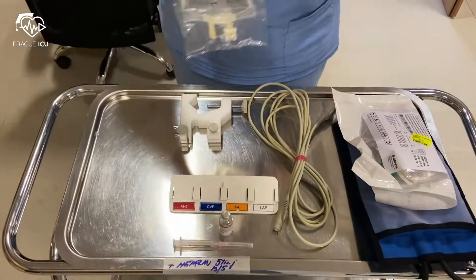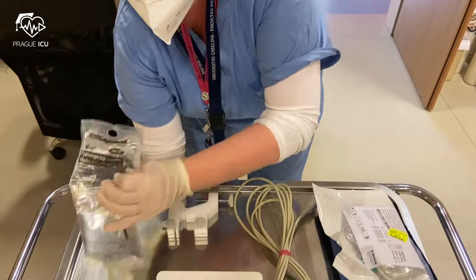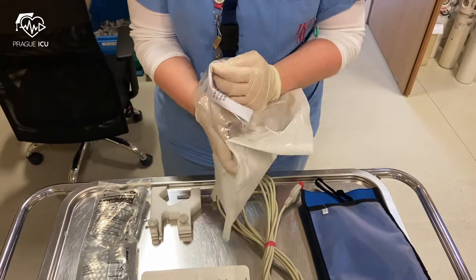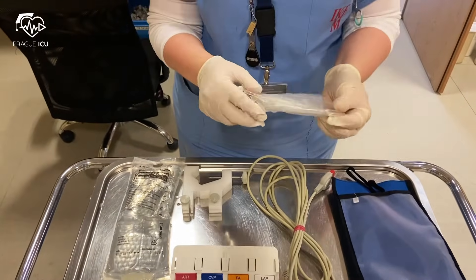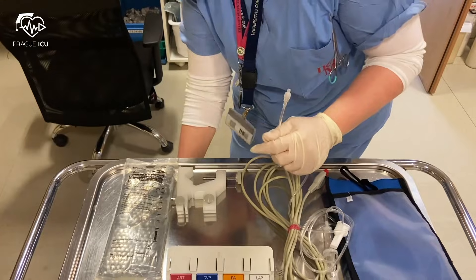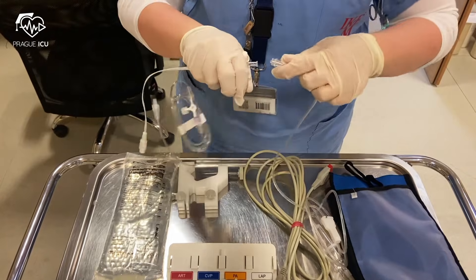For invasive blood pressure monitoring, either venous or arterial, you need to prepare the following equipment: normal saline 500 cc, a transducer kit which comes along with flush tubing and pressure tubing, as you can see on the video. You can also see a transducer cable, pressure bag, transducer holder, and an IV pole, which is already prepared at the bedside.